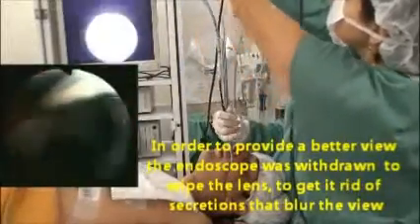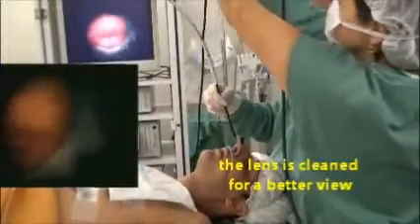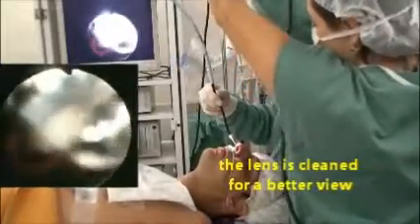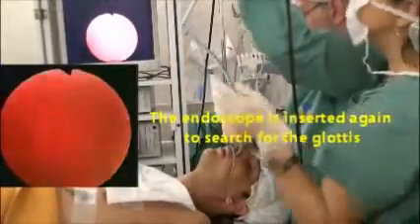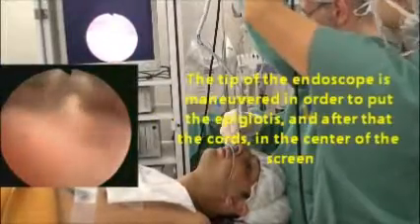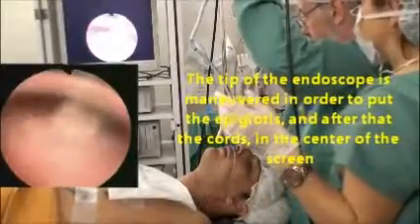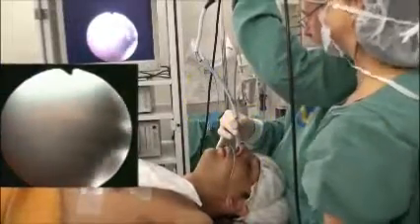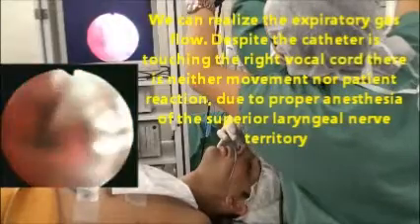Since the view was not the best one, we decided to withdraw the scope and clean the lens, wiping it out of the secretions. Once again, we introduce the endoscope through the nare and get lost with some pink outs inside the nose. After finding the tip of the epiglottis and the vocal cords, the epidural catheter is now threaded through the vocal cords to anesthetize the subglottis, that is territory of the recurrent laryngeal nerve.